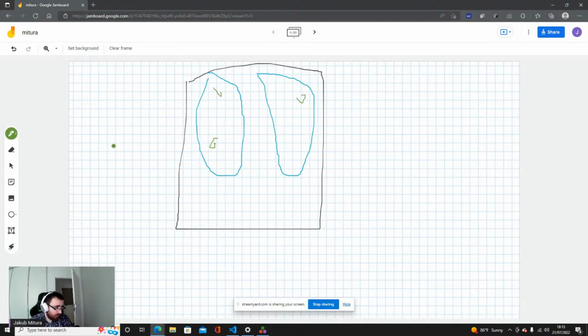If, let's say, only 1% of the voxels are true tumors, the algorithm would just tell that everything is background. Yes, so there is no tumor at all. It will get 98 or 99, basically extremely good accuracy. Yes, very small error, although it would be completely rubbish. It would be completely useless, but it would still get a very good metric.